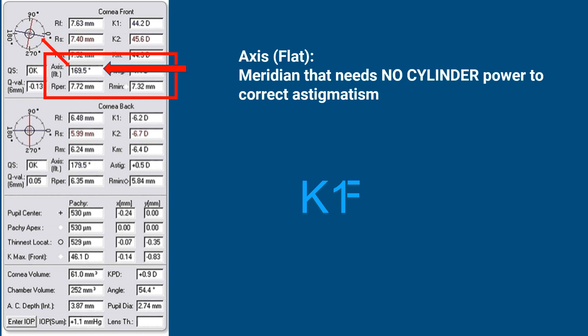This value is the axis of the flat meridian, which means the axis of K1. It is also presented in black on the map, so they should correspond — for example, here it is roughly 169 and it is 169.5 there as well. This is the flat axis meridian, which needs no cylindrical power to correct the astigmatism.